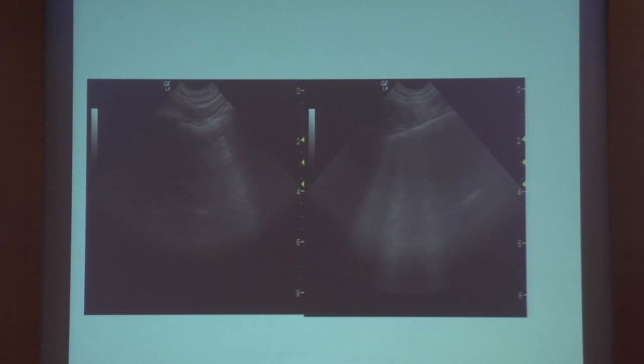So if you see this, it means there is fluid. And it is a very strong suggestion that your patient may not take any more fluid. In fact, your patient may need to be diuresed to get rid of this problem if it is indeed cardiogenic pulmonary edema. So it is, as I mentioned, fairly simple to distinguish. These are called B lines, or comet tail artifacts arising from the pleural line.